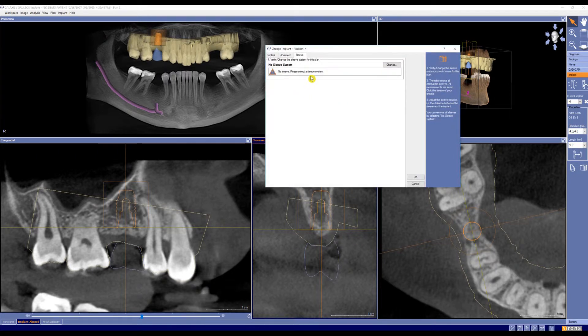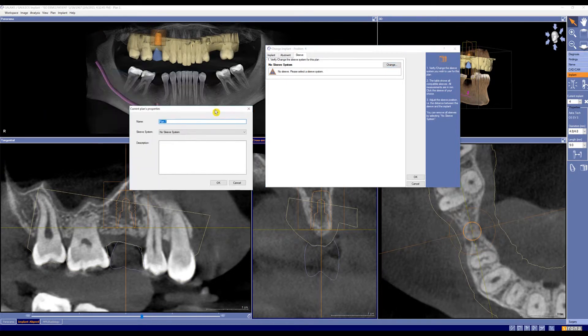As you can see, currently no sleeve system has been chosen, so we're going to change that. From here, let's click the drop-down menu and change that from no sleeve system to Serona CEREC Guide Drill Keys and CEREC Guide 2 specifically, and click OK.